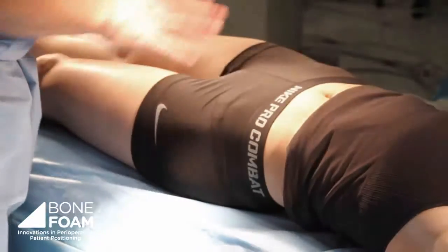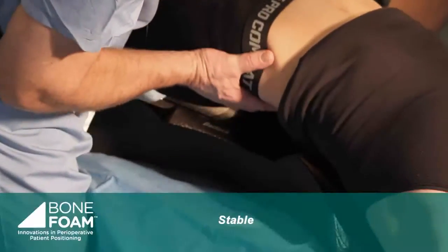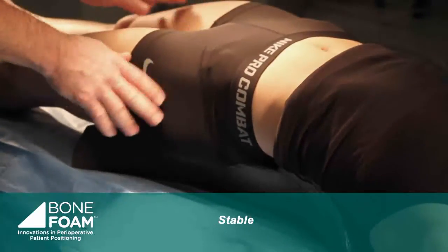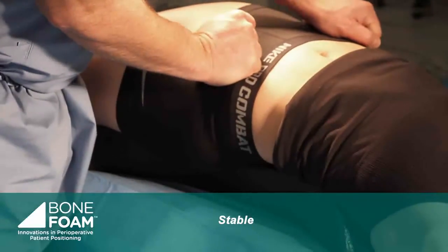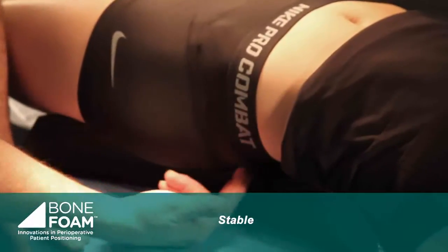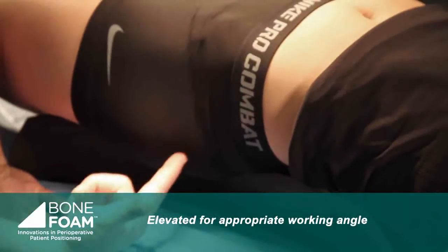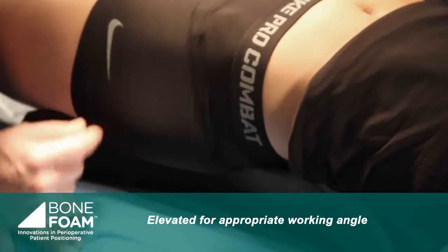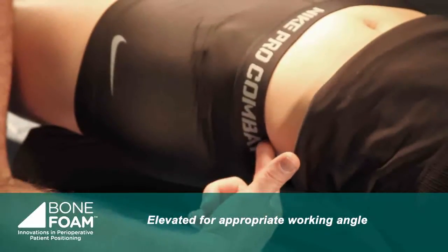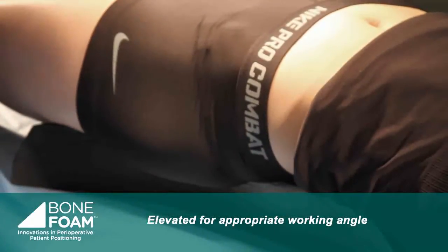What I'm going to do is slip this under the patient with this orientation, just like I've shown. We're going to lift the patient here, back down, and now the patient is very stable. So even if you're doing manipulations on the pelvis, you can see that the patient is built up very significantly. The buttock is hanging over the side here because we need to get posteriorly, typically at this vector, to get our iliosacral screw fixation. Or the other possibility is for anterior column screws that may go in this direction. Again, the surgeon has to drop their hand with the drill, or also to get from the pubic symphysis up the anterior column.